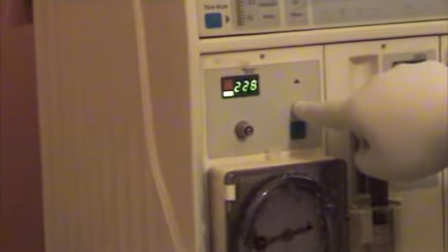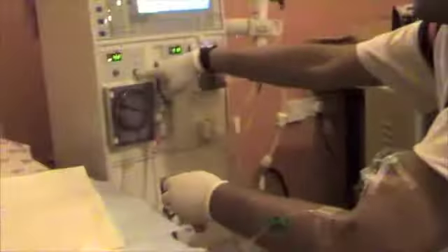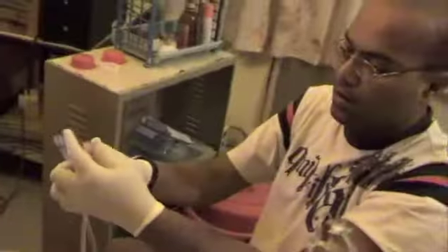Reduce the pump speed and get ready to connect. Stop the pump, clamp the lines. The red always goes to the artery, so connect the arterial line and start the pump.